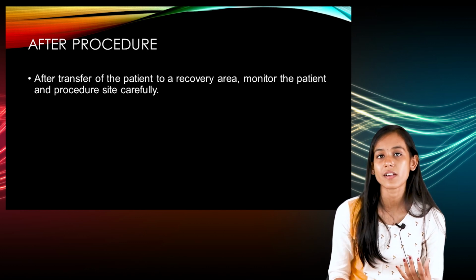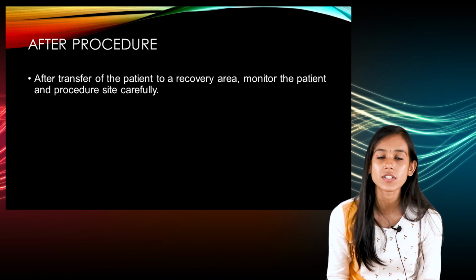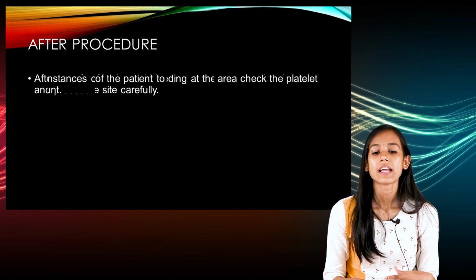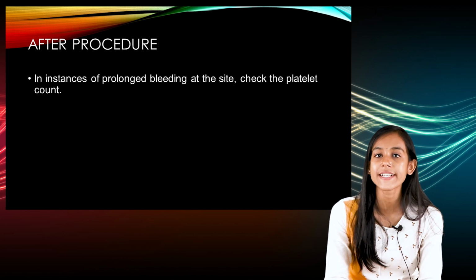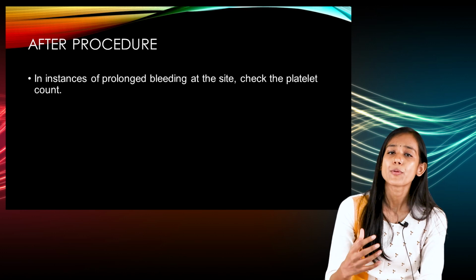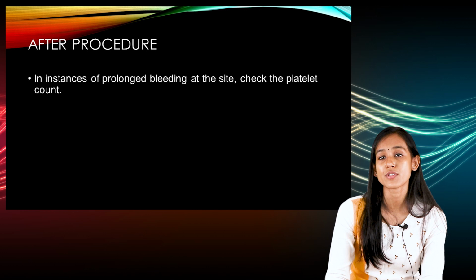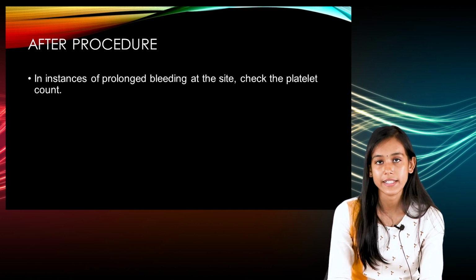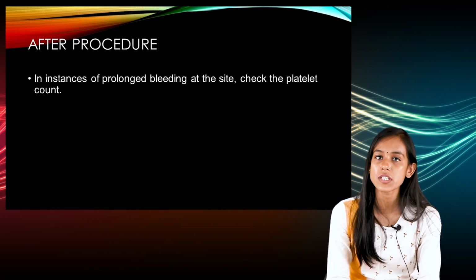You need to monitor the procedure site carefully for any signs of infection. And the next thing is that if you have noticed severe or prolonged bleeding at the site during the procedure, or after the procedure it is still going on, in that case you have to check the platelet count, because there might be a need for platelet transfusion.